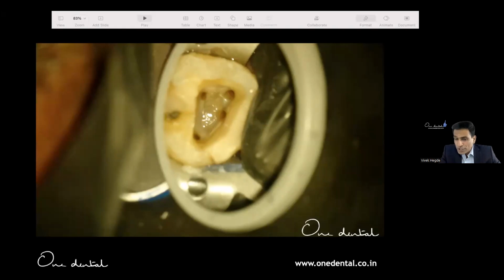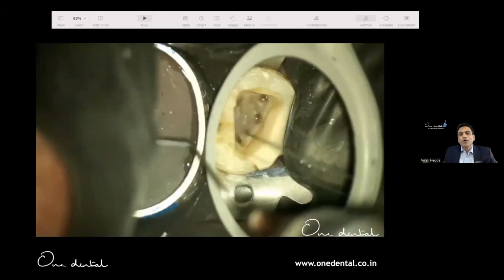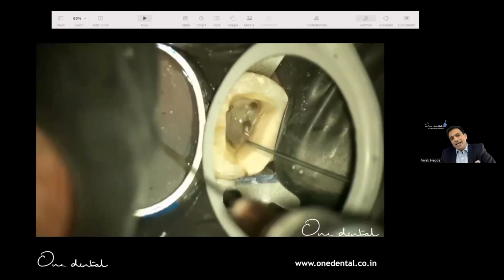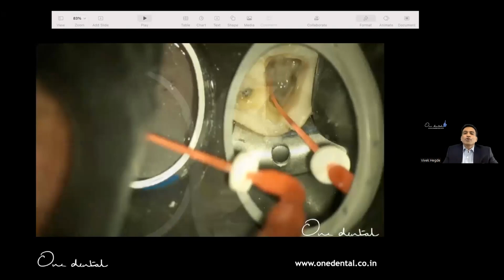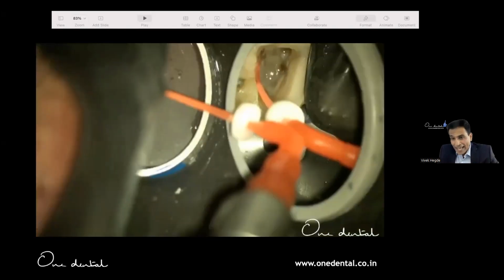Do you have some more systems? Of course, I'm only showing you the systems I've used. Maybe there are more in the market, more in the world. I like to invest in a lot of endodontics, and we have this. So here you see, this is called PATS. Again, it's a sonic. It's an air sonic, I would say.